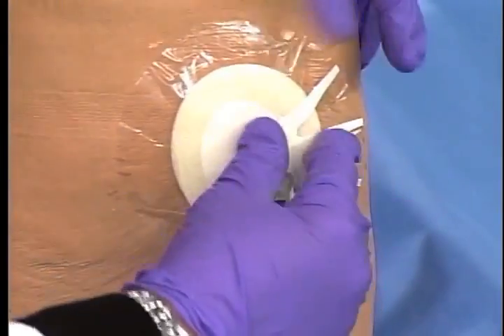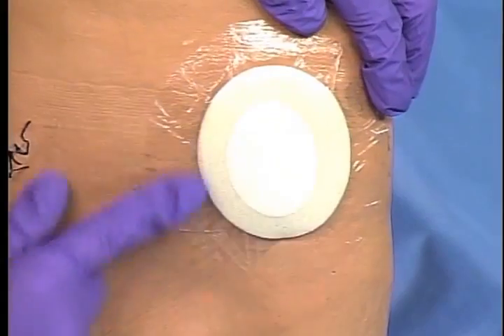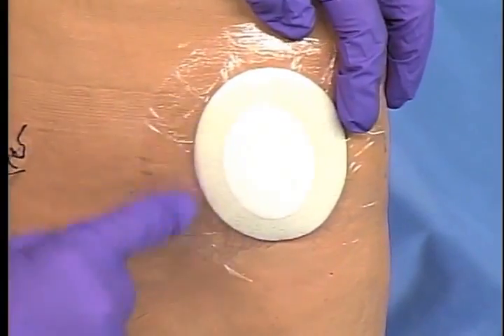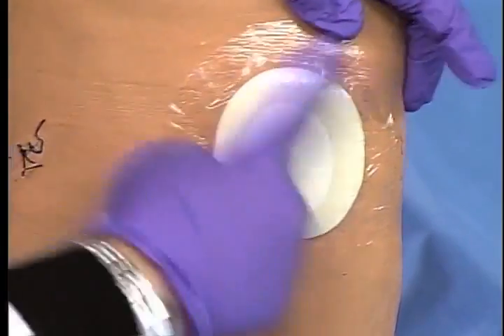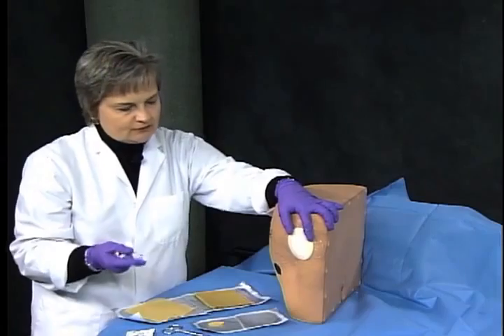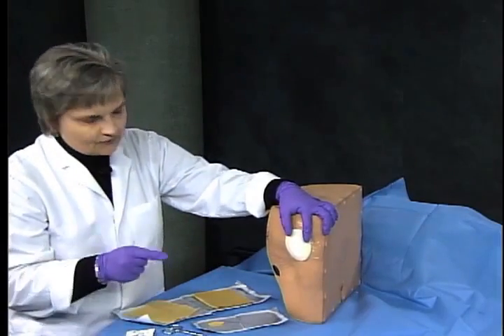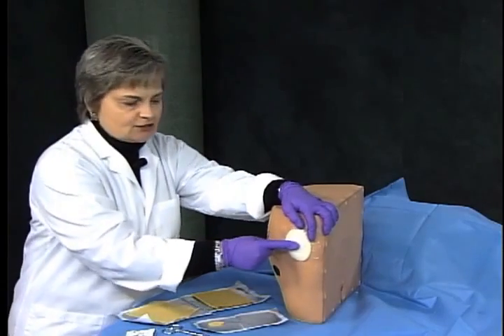This happens to be a foam adhesive dressing with barrier properties. So especially if you've got a wound that you're dressing that's vulnerable to contamination with urine or feces, it's very, very good to use a cover barrier dressing. Also, in terms of selecting your cover dressing over your silver dressing, what's going to drive that selection is how much drainage you actually have in that wound.